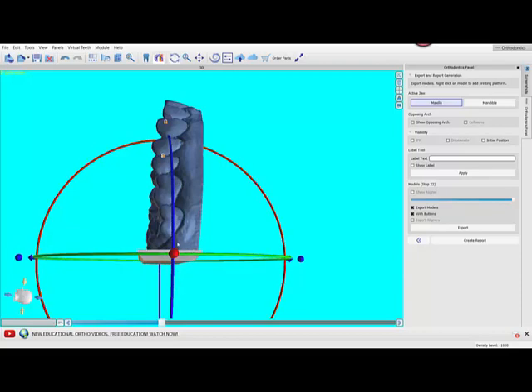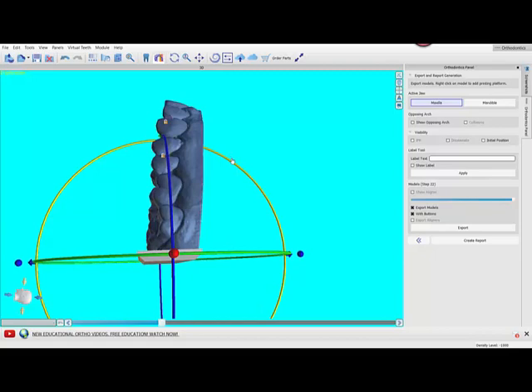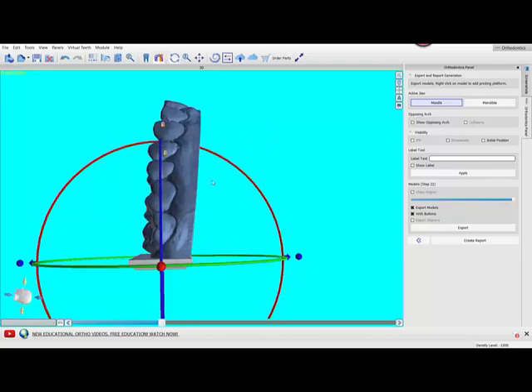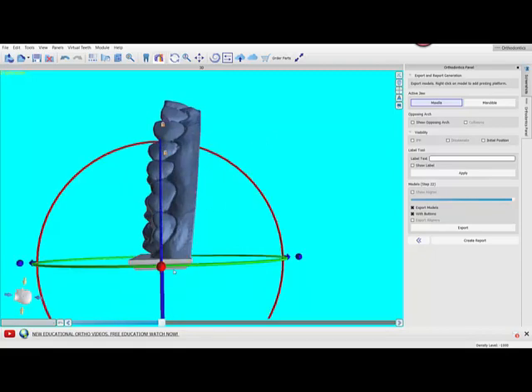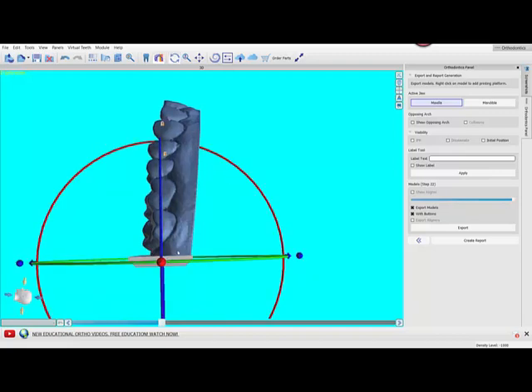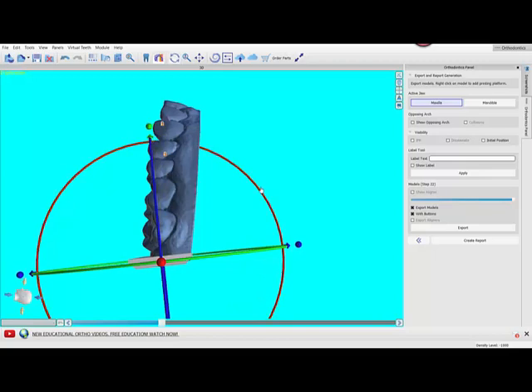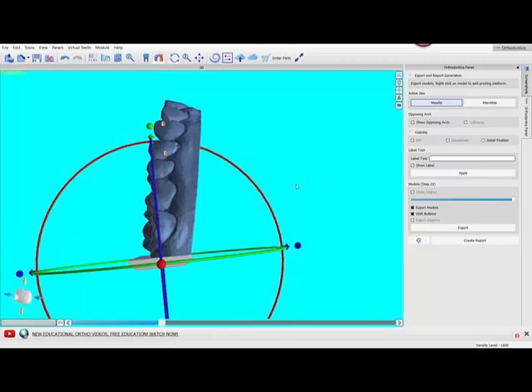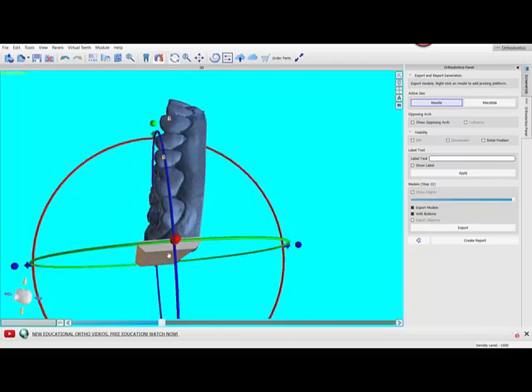Bear that in mind. I usually tip this back—you know, if it was originally here, I tip it back. You can see the blue line coming up to about the embrasure space, so it's about five or so degrees tipped back. If you're missing a tooth I'm gonna go farther, 10 to 20 degrees, and I'm just kind of watching the edentulous space.